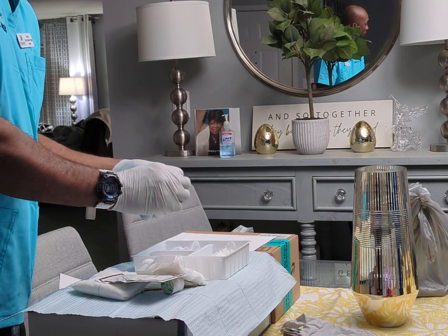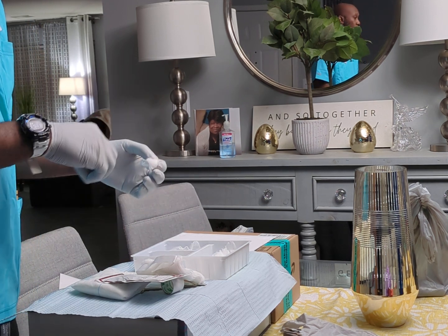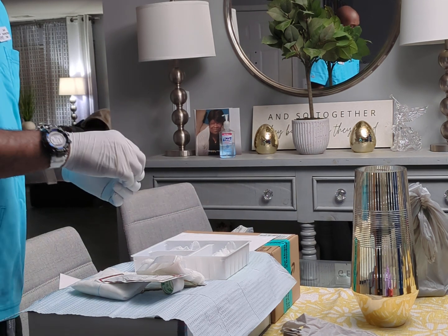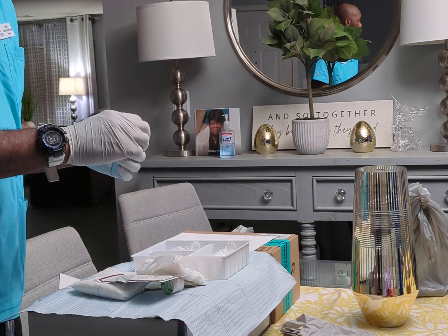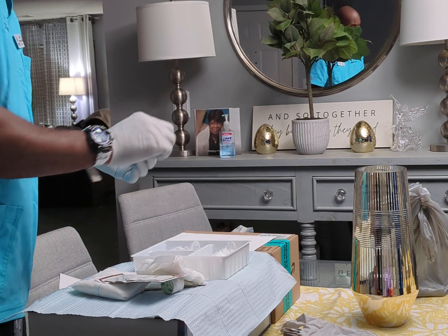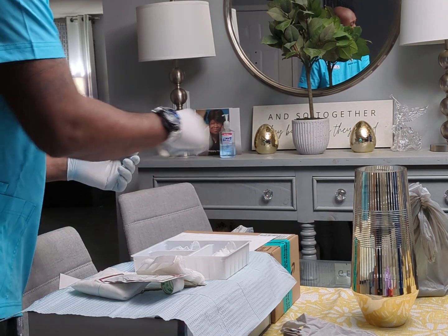I'm going to go ahead and drain my gauze out, making sure I don't drip anything on my sterile field, because if I do, I will have to start again since my sterile field will be compromised. Okay, so now from the center of the wound, in a circular motion out, I will clean it.